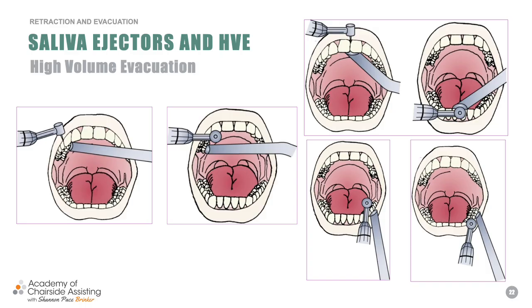One of the things that's really important is just not being in the doctor's view, okay? So you can see where it is. If he's going to come to the incisal edge or towards the lingual, of course, I'm going to move back a little bit more, because most of the time when they're in that area, they're going to put the mirror in, right?